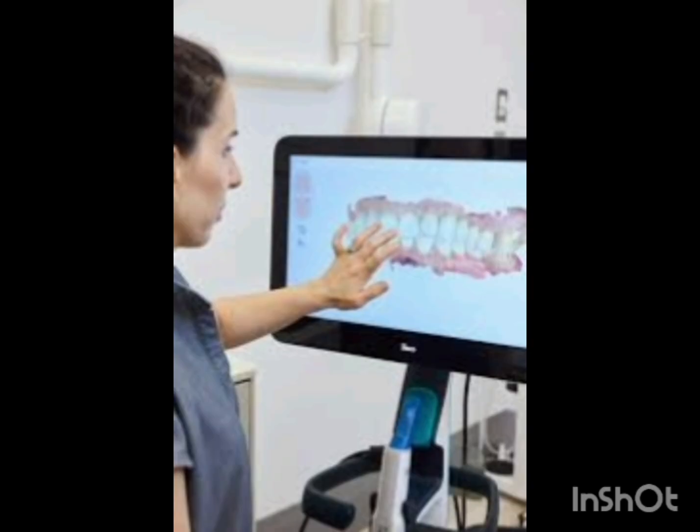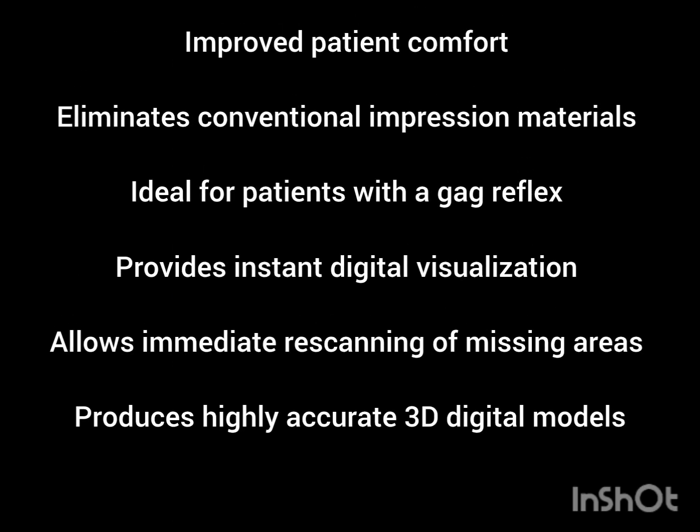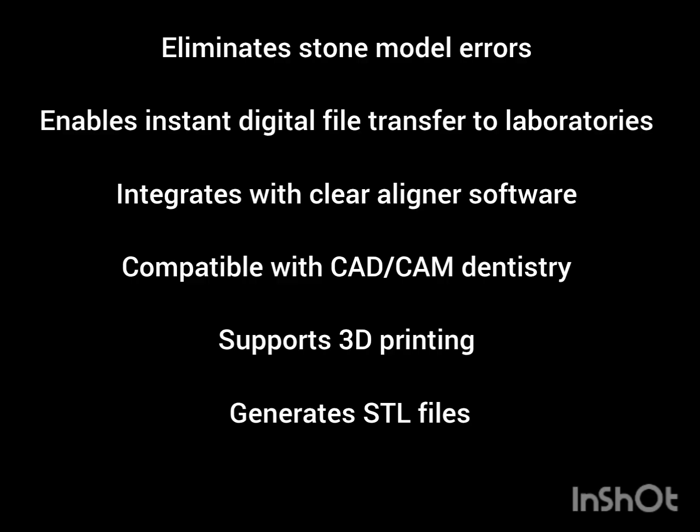And the advantage of the intraoral scanner is that first it provides greater patient comfort by eliminating the impression tray and impression material, making it particularly useful for patients with a strong gag reflex. Second is that the scans can be viewed immediately on the computer screen. So if an area is missing, it can simply be rescanned instead of repeating the entire impression.